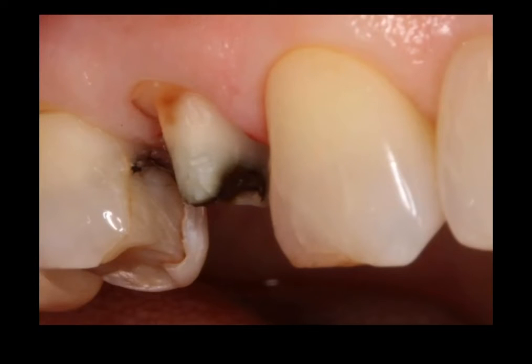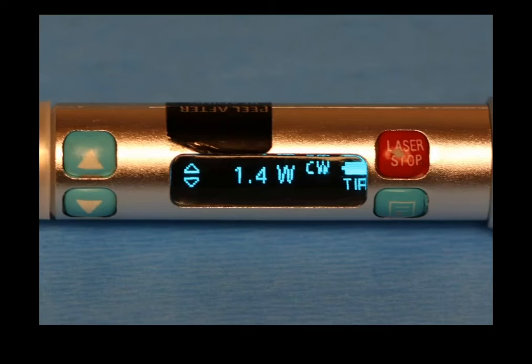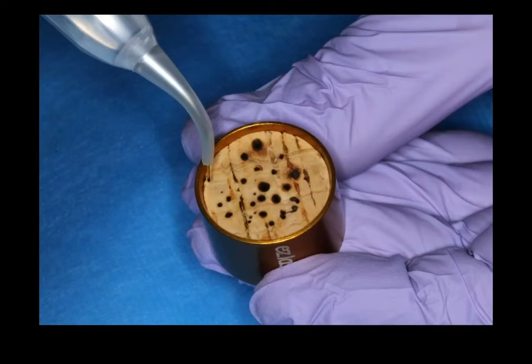We prepare the site. And those of you who heard me before, my implant margins are at or slightly subgingival. And with today's materials, our preparations are slightly subgingival. I know we have other work to do on other teeth in this situation. We'll be doing other crowns on this patient. But we prepare the tooth and we will use our diode laser. And here, these are all preset for us. This is for troughing. It's set at 1.4 watts. CW is continuous wave. And we'll simply have our cork and we will initiate the disposable tip into the cork.